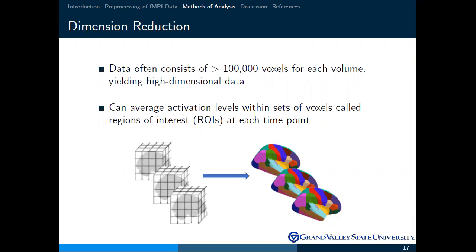And to talk about the size of this problem, when I would analyze data, we would typically use anywhere between 10 and 50 ROIs, although some atlases use as many as 200 or 300 ROIs. So you still have a decently large problem. Compared to 100,000 it's much less, but even with 300 brain regions, that can still cause a lot of issues for some statistical models.